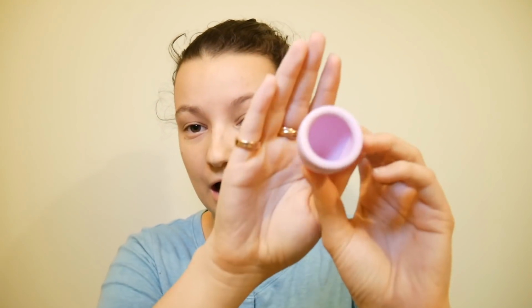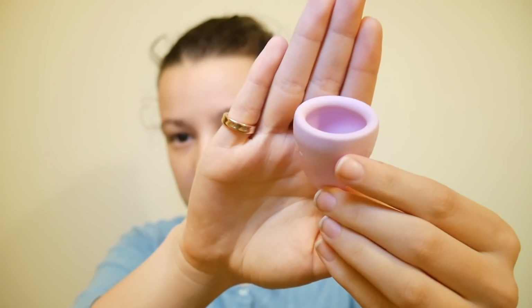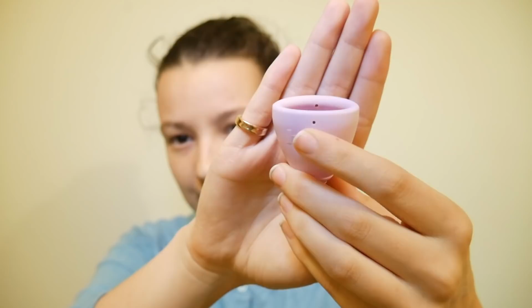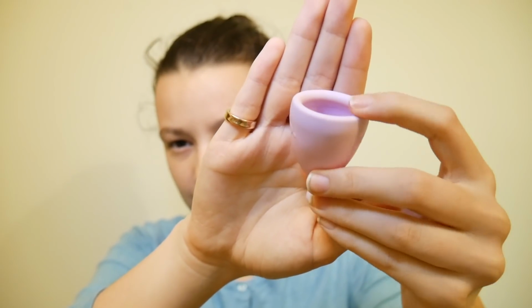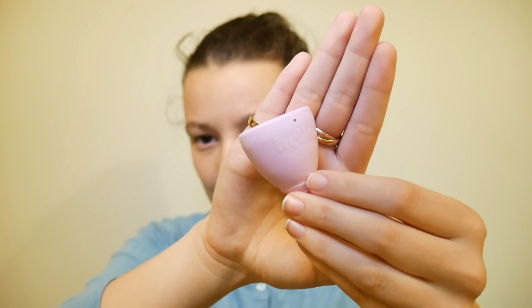The only other gripe I have with it, if it could be called that, is that this thing stains so easily. I don't know if you can see. I've only used this cup like three times or so. It might just be this particular colour, but it's stained on the inside of this rim, just in here. I don't know if it shows up on the camera, but there's definitely a sense of staining around here. It's got a little bit more brown, and I've scrubbed it really hard and washed it out, but I can't get it to go.